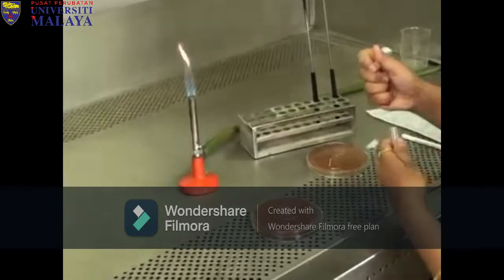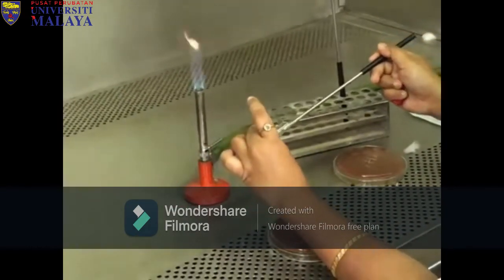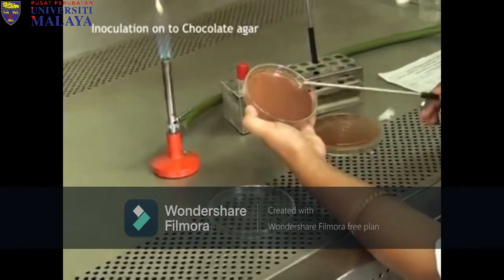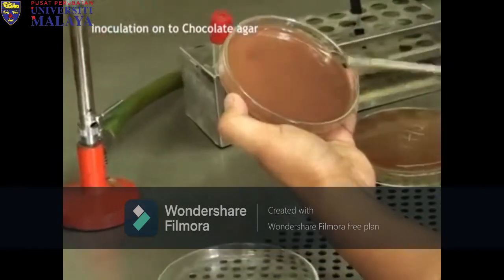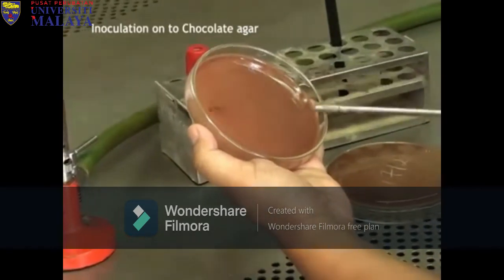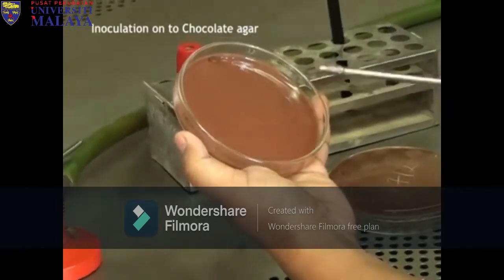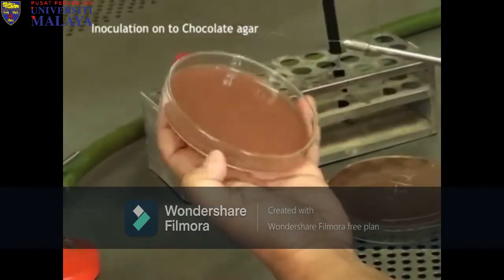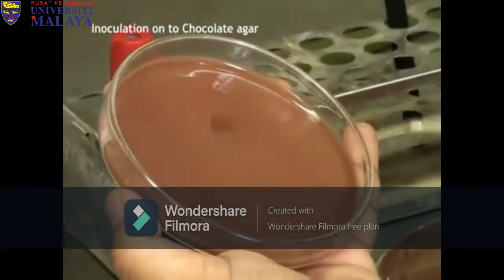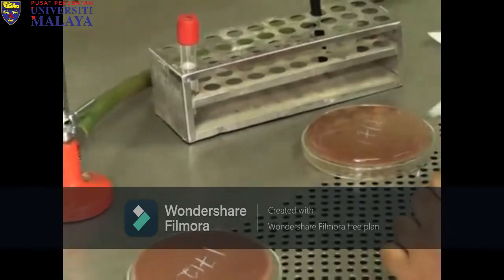Next, CSF culture media can be done to confirm the meningitis. Firstly, inoculate 1 to 5 drops of CSF directly onto both a blood agar plate and chocolate agar plate within 1 hour after collection. A backup broth is needed to inoculate with some of the sediment pellet. An example of backup broth used is brain heart infusion broth with proper supplements. Agar plate and broth inoculated with CSF sediment should be incubated for 18 to 24 hours at 35 to 37 degrees Celsius with 5% carbon dioxide.